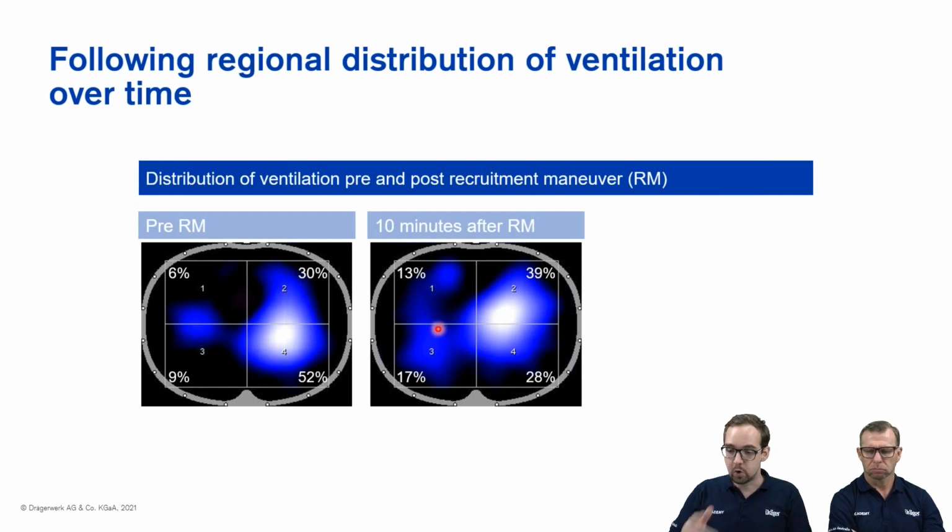So going back to these two slides, as a very easy rule of thumb to really understand what is going on inside the patient's thorax, it's highly beneficial to look at a before and an after picture. It tells you immediately whether you are achieving what you want to achieve. So in this case, recruiting this part of the lung.